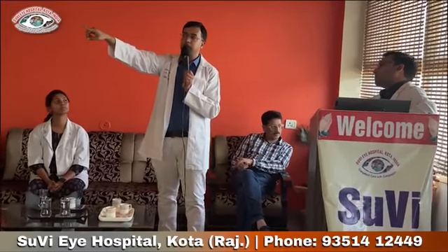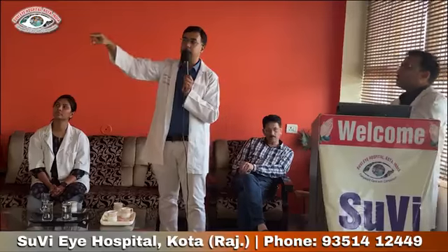The aim is to cover the anterior border, because, as you have rightly mentioned, if the anterior border is not properly lasered, there is a risk of retinal detachment. And one more thing: excess barrage is also not good.